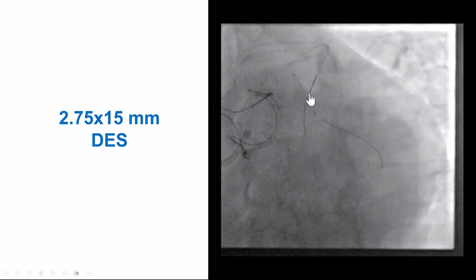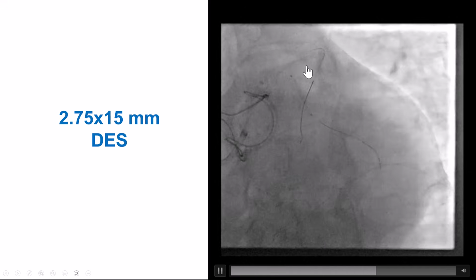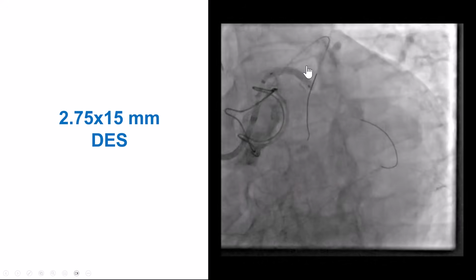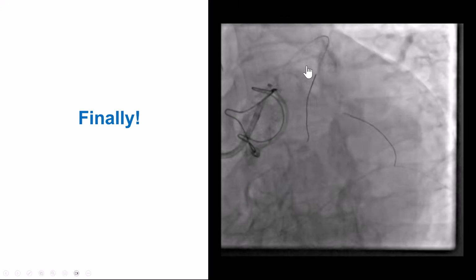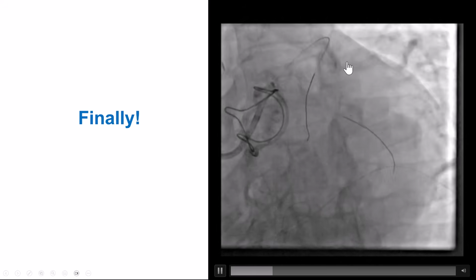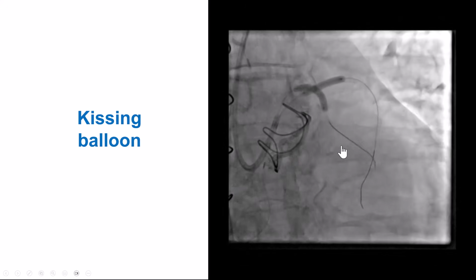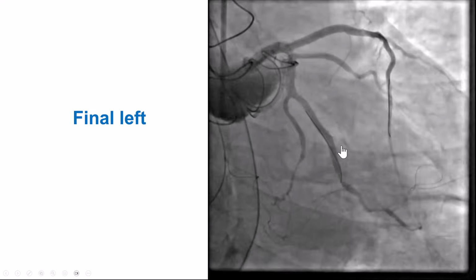The stent was repositioned after removing the guide extension all the way from the left main. And then we were able to deploy it. We're concerned about OM1, but we decided we just had to do it. And fortunately, after doing that, now we do have good flow going down the circumflex. We still have maintained OM1, OM2, distal circumflex. And after rewiring the LAD, we did kissing balloon inflation and had a nice final result.